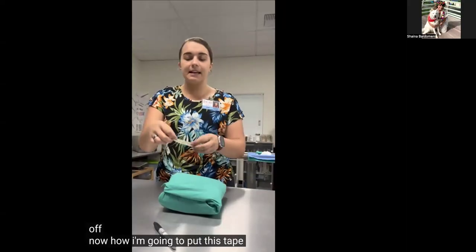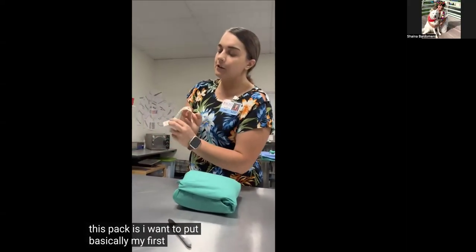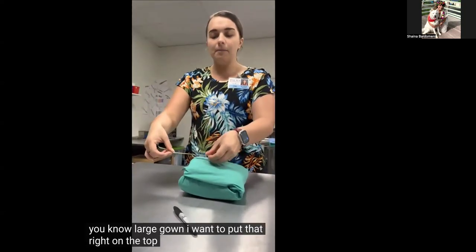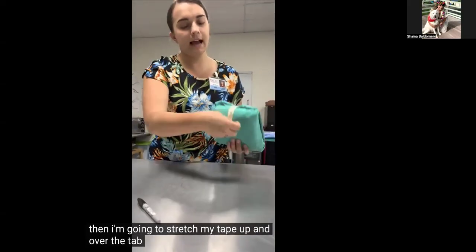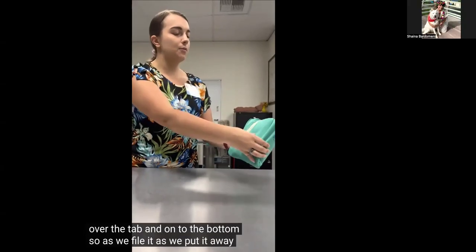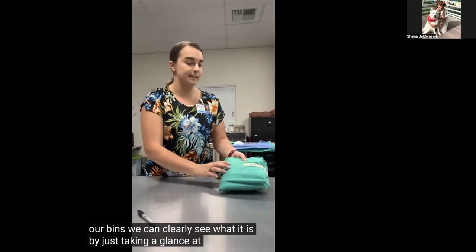Now, how I'm gonna put this tape on this pack is I wanna put basically my first line where it says large gown, I wanna put that right on the top. Then I'm going to stretch my tape up and over the tab and onto the bottom. So as we file it, as we put it away in our bins, we can clearly see what it is by just taking a glance at it.